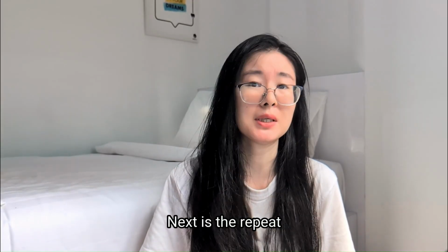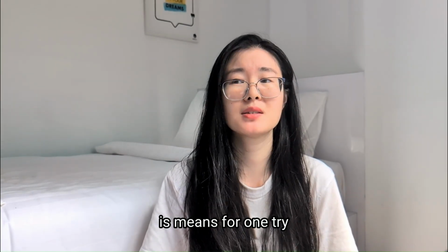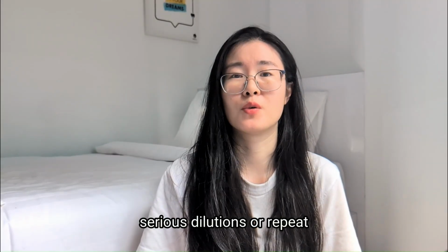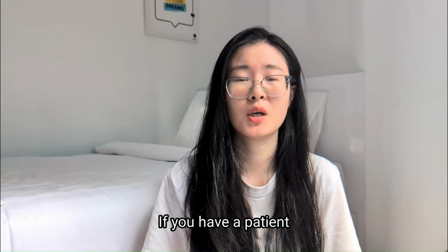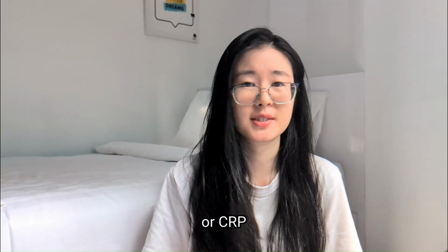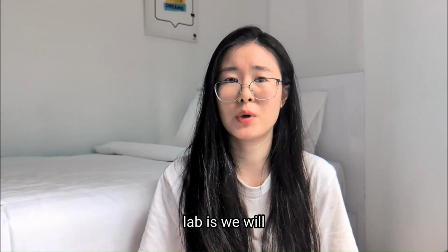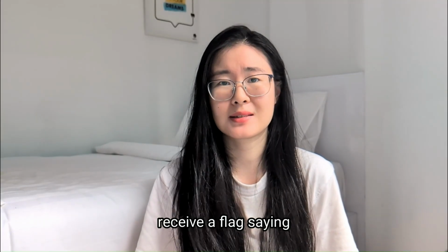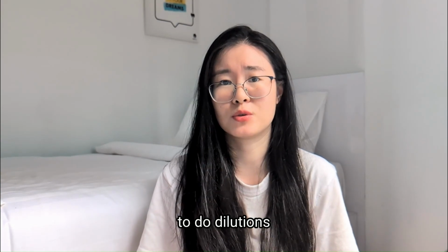Next is the repeat and dilutions. The minimum volume on a test catalog means for one try, not for series dilutions or repeats of the test. So here is what I mean. If you have a patient with very high glucose or very high HCG or CRP or something like that, what happens in the lab is we put it on the analyzer for one run, and then we receive a flag saying, oh, this is outside of the testing range and we need to start doing dilutions.